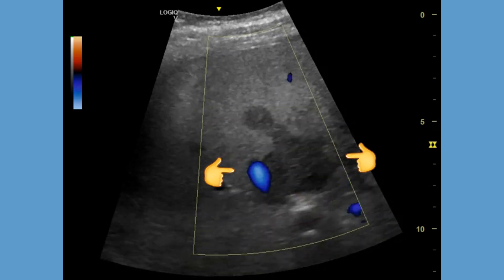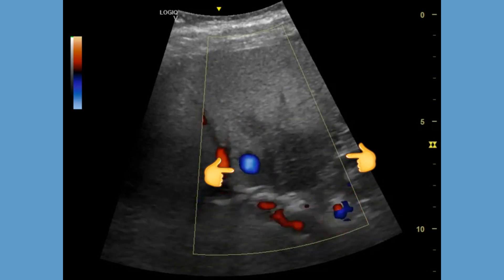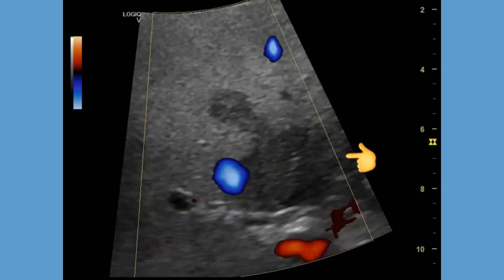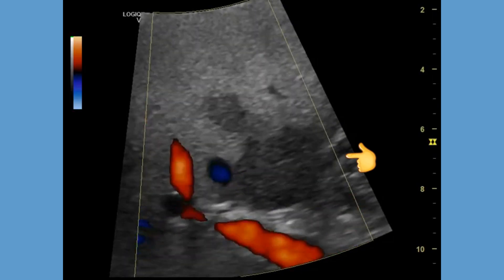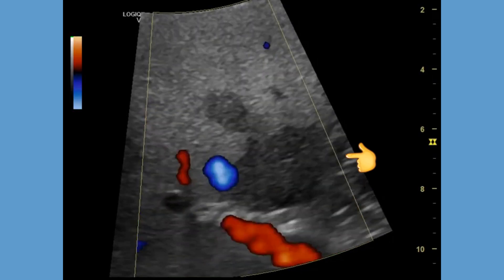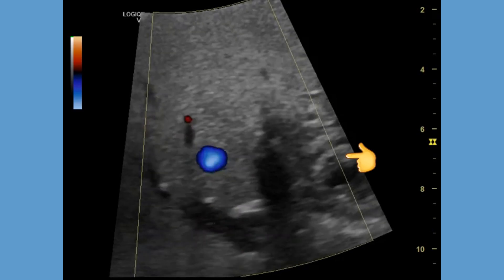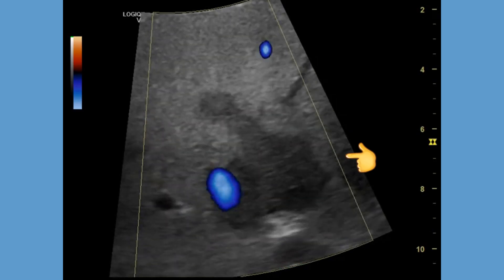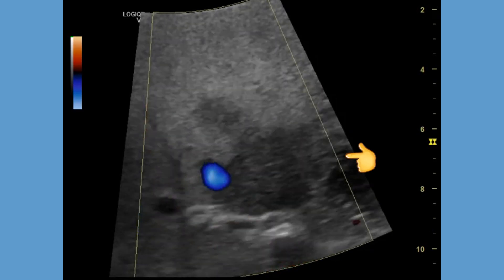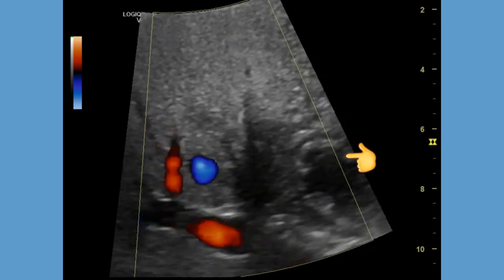Focal fatty sparing is usually hypoechoic or isoechoic on ultrasound. Color Doppler shows normal blood flow in this region. As in this case, the lesion may have a geographic shape and is typically close to the gallbladder fossa.